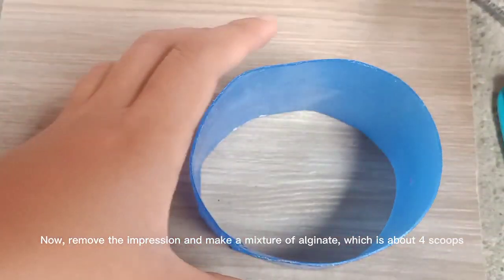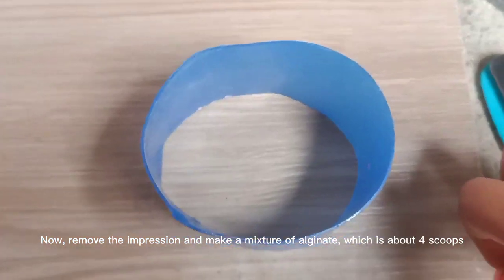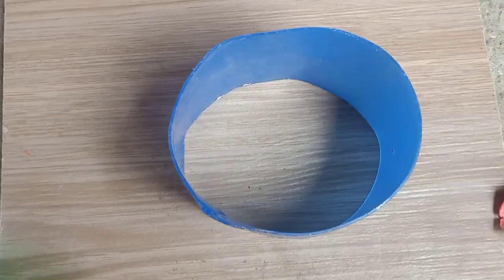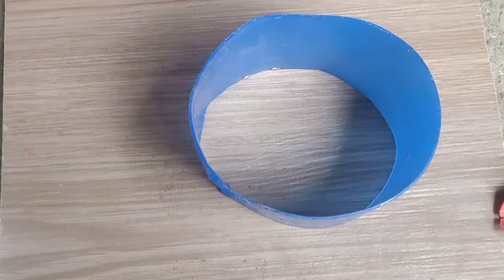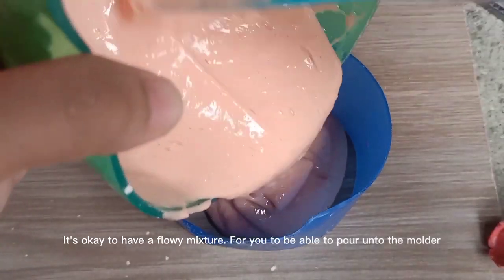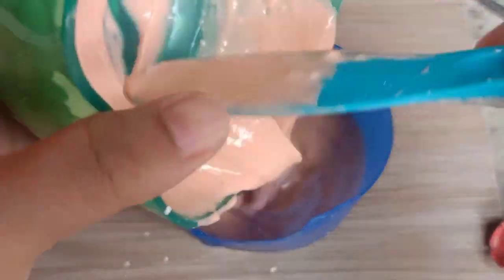Now, remove the impression and make a mixture of alginate, which is about 4 scoops. It's okay to have a flowy mixture for you to be able to pour onto the molder.